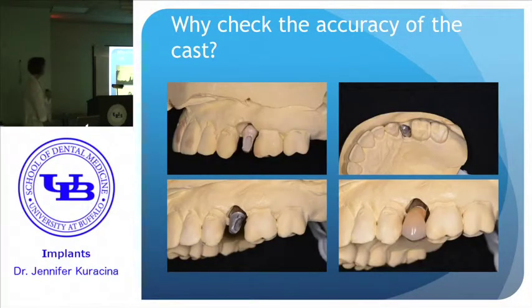That does happen. And then this is one of my patients, and this is stuff I do fairly routinely, and this is the wax up on my cast, and I had it scanned, and that's how it fit in the patient's mouth. I made a new fixture level cast, so I hadn't seated it all the way, and I made a mistake.